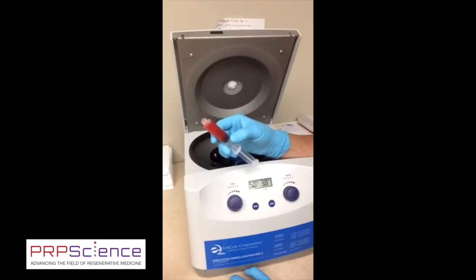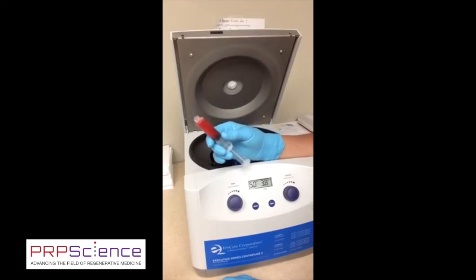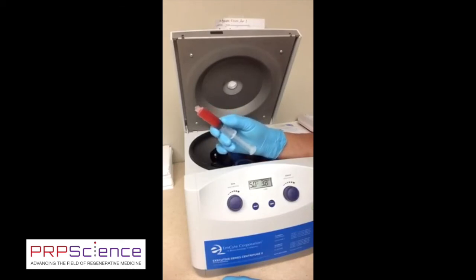Now, what I have also found is that although this is a physiologic pH product, many people will have significant discomfort based on their own pH. So I buffer the plasma with, again, approximately 5% of the volume of sodium bicarb. So in this particular case, if I have 10 mLs of PRP, I'm going to put in 1/2 ml of bicarb. I can do that anytime. It doesn't activate the platelets. And then just before I inject, I'm going to add another 0.5 mLs, or 5% of the volume, of calcium chloride, 10% solution. All right? So I'll actually end up with 11 mLs in this syringe. And that'll be great.